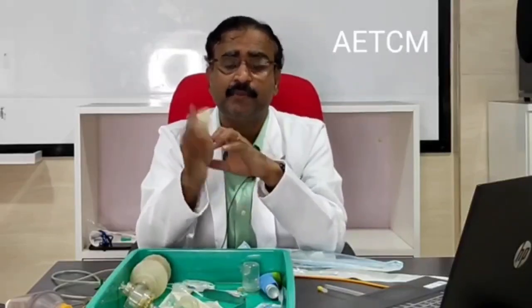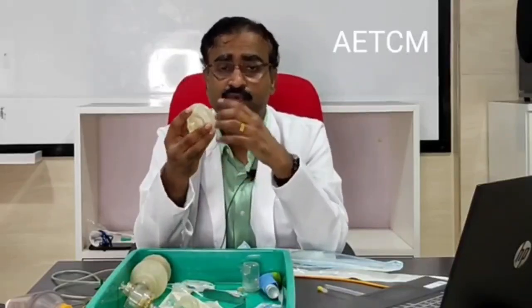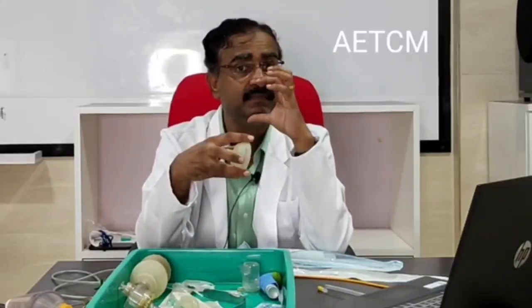Now how do you choose an appropriate size mask? An appropriate size mask would cover the lower part of the nose and upper part of the chin. It should seal completely in such a way that there is no leak of oxygen or air from the sides of the mask.